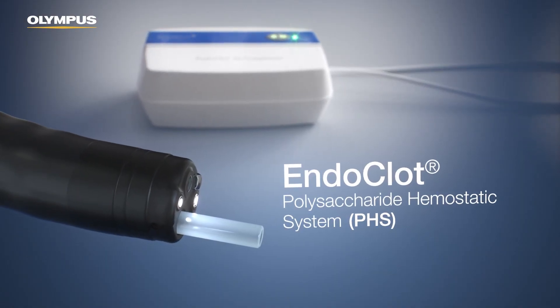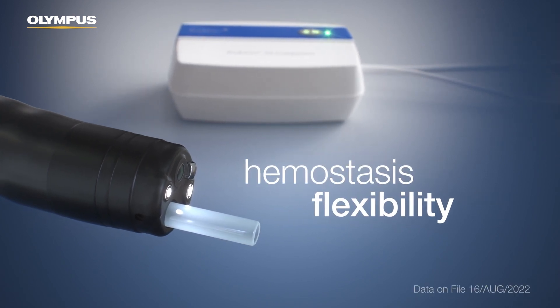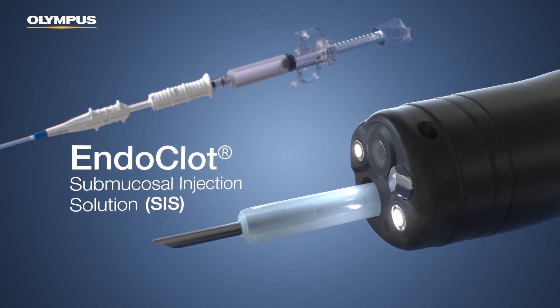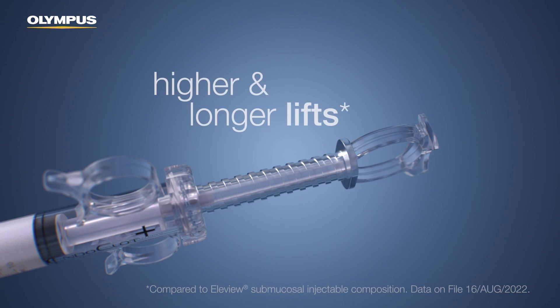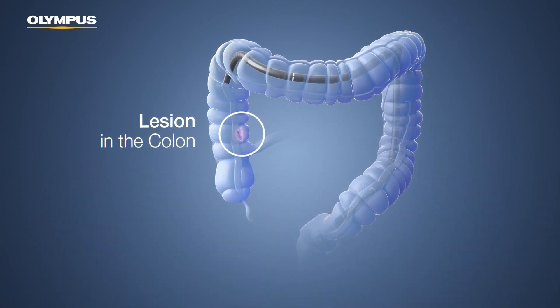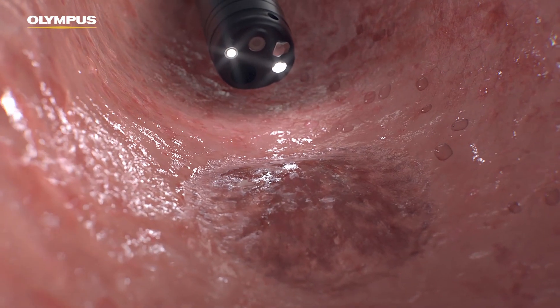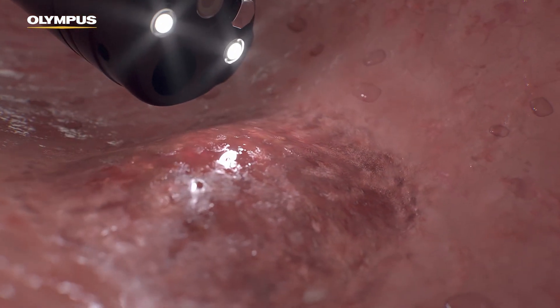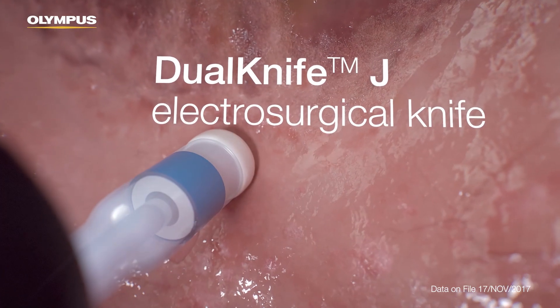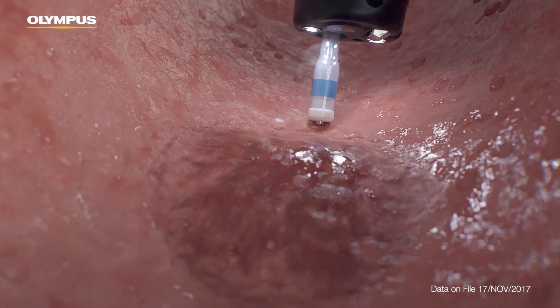Introducing EndoClot Polysaccharide Hemostatic System, PHS, intended for hemostasis flexibility. An EndoClot Submucosal Injection System, SIS, intended for higher and longer lifts. The versatile Dual Knife J Electrosurgical Knife can be used to incise, mark, inject, and dissect.